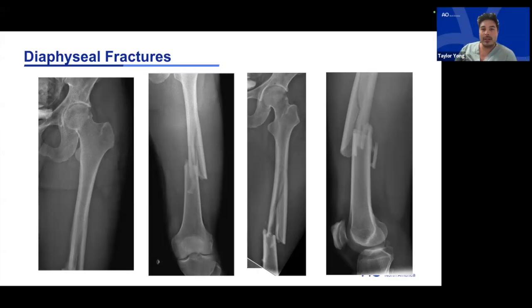What about you, Lilia? What do you guys do? Or what were you doing at Harborview, maybe? We typically utilize our trauma CT scan, which is fine cut pelvis CT. MRI is not really utilized in the emergency situation. And then we use our intraoperative checklist to make sure there's no occult femoral neck fracture after that. Yeah, we're the same.